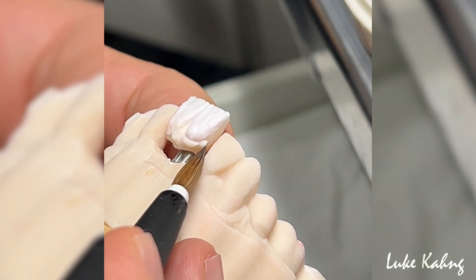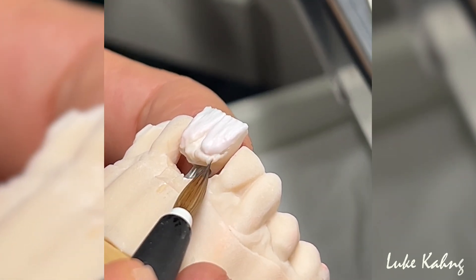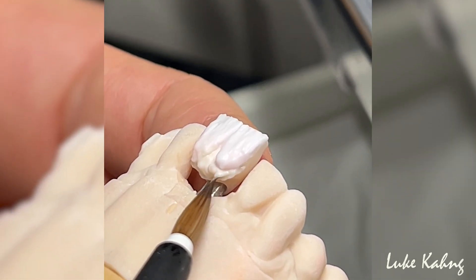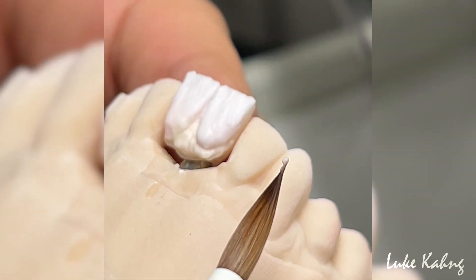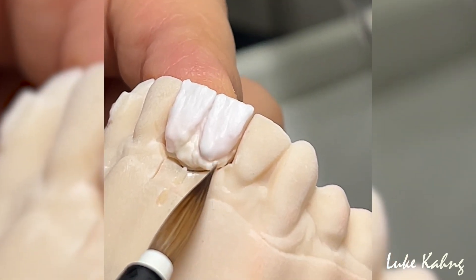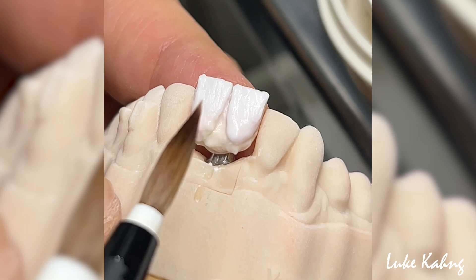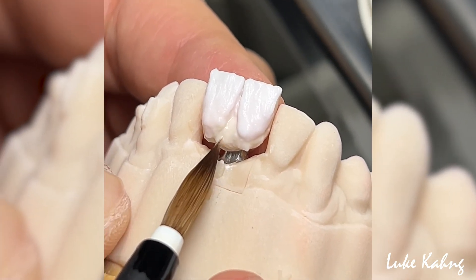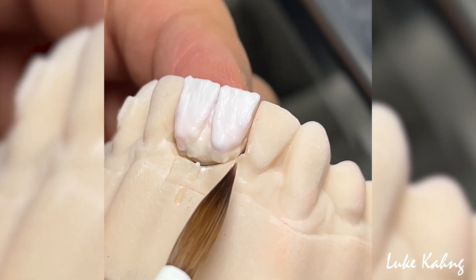Then, we perform a buildup on the zirconia. After performing the buildup, the zirconia is baked in the oven a second time.